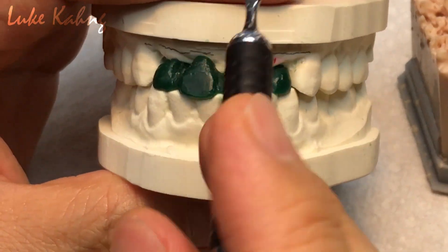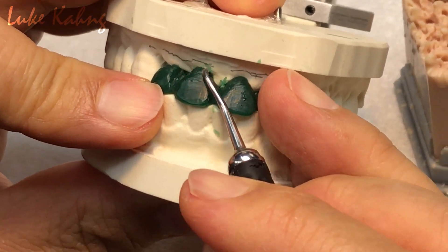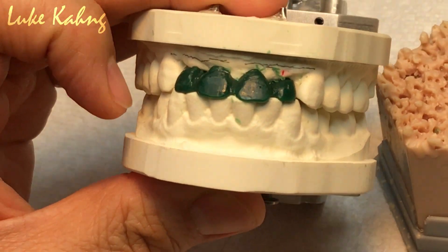Draw it. So we see, then I cut it. That one is my finer tissue contour. Make sense?